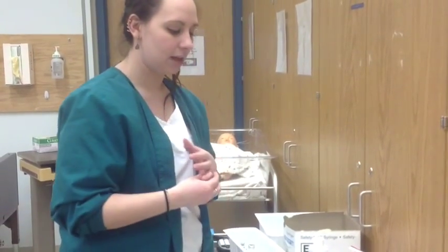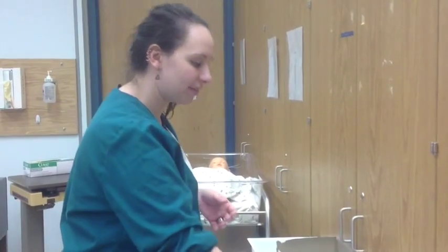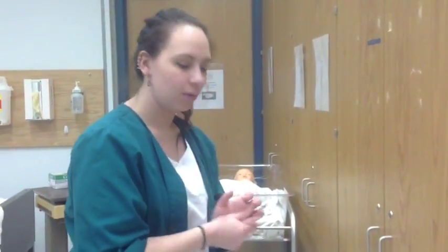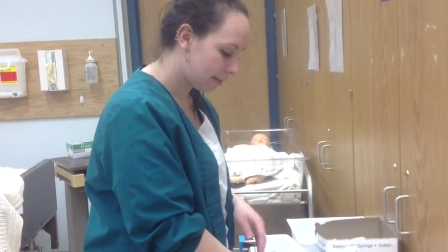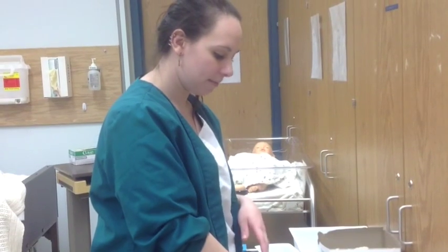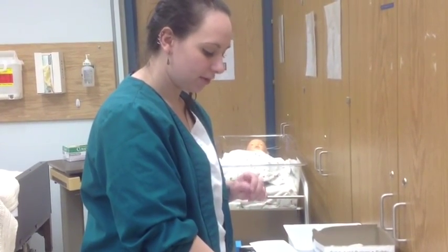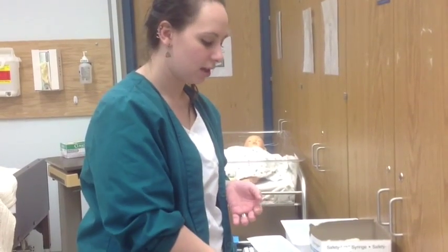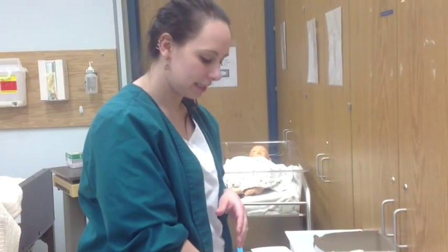This one says it's Baby Charles. So, Baby Charles, and it's for 11 a.m. The time's 11 a.m., so I'm looking at the right medication. Now I'm going to go through and look at what he needs. He needs a hepatitis B vaccine for today at 11 a.m. It's calling for 0.5 mLs, which is within normal prescription limits that I would expect to see.